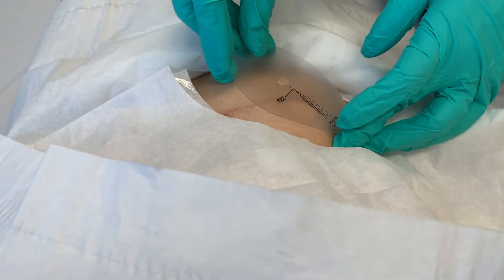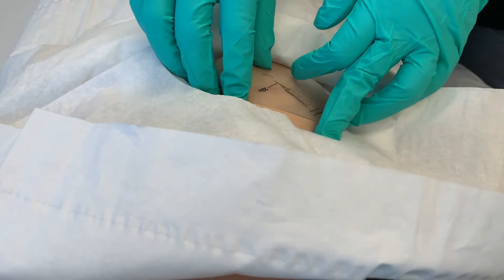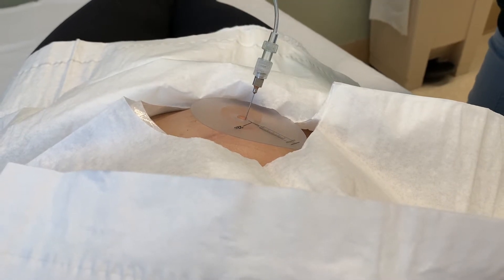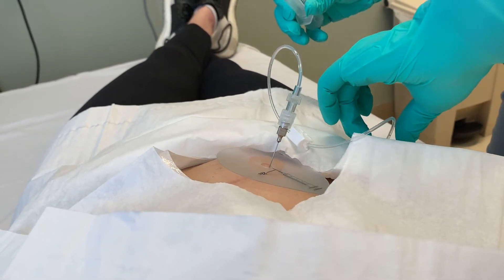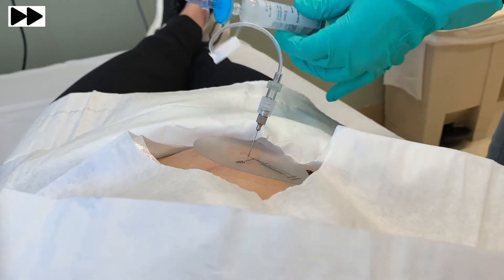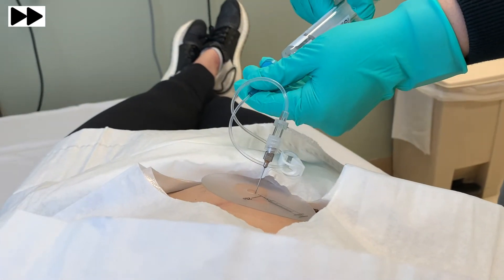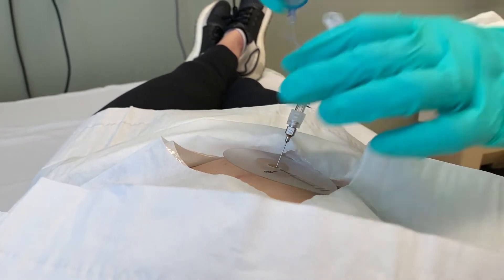Once Debbie has been disinfected they use a template to find the refill port. They use a needle — needle warning — to find the refill port. They then remove the excess baclofen. Once that's been done they clamp it off and then use a syringe to insert the new baclofen. There's a blue disc connected to the syringe which is a filter to make sure that nothing gets into the pump that's not supposed to. Once that's done they clamp it off and the needle gets removed.